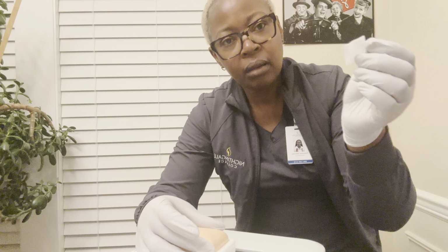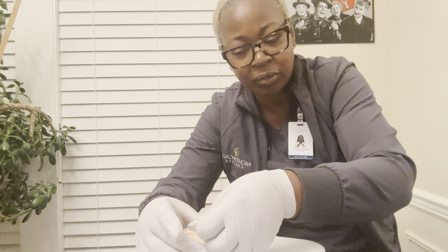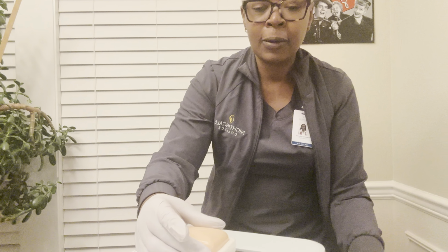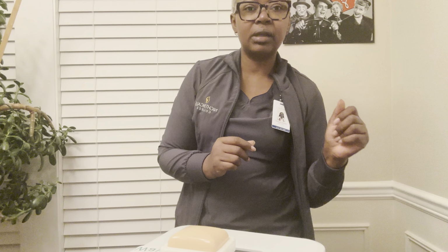I will use a bandage to gently press. I'm not going to massage, I'm just going to press and check there's no blood coming out. And I will remove my gloves, perform hand hygiene, and document. Thank you.